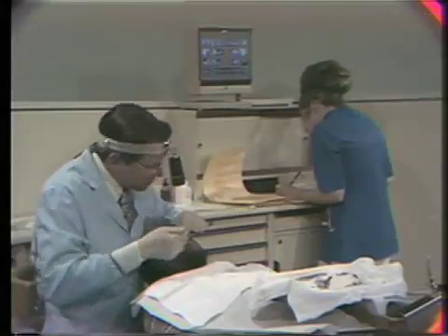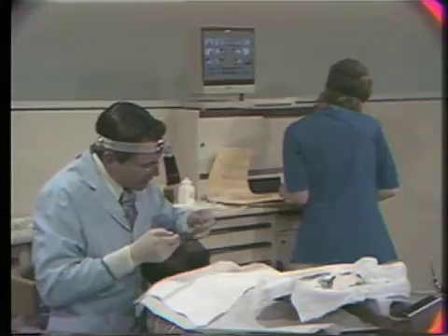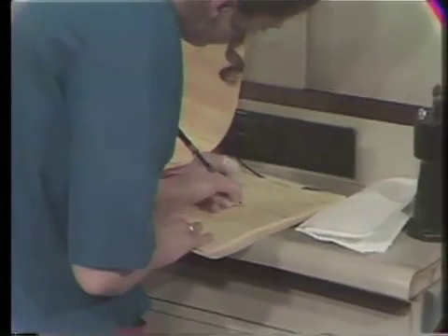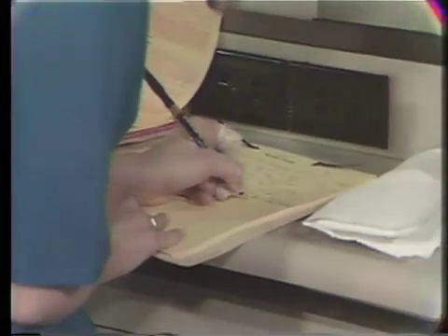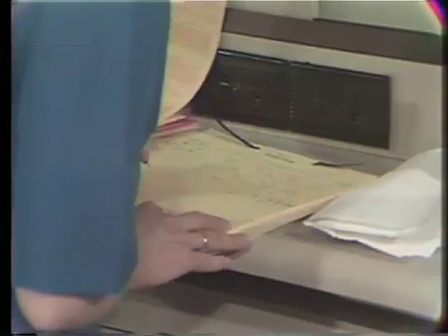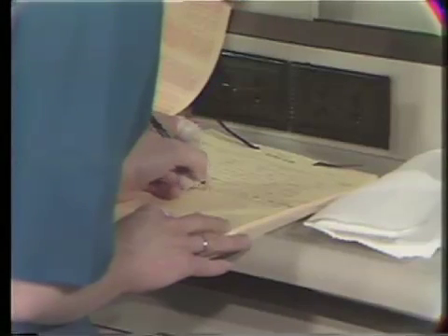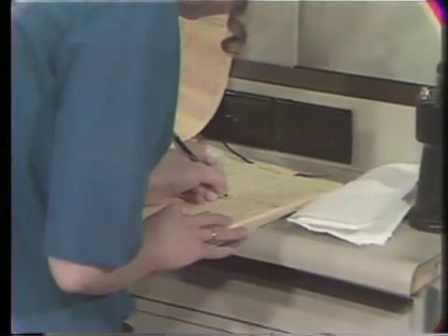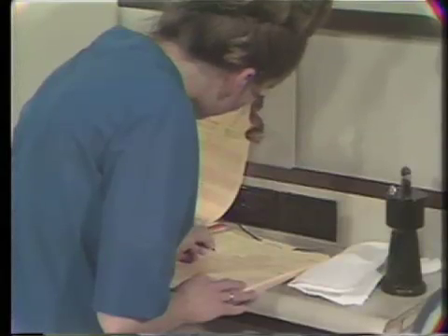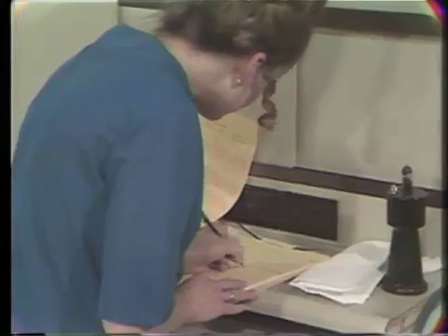Two and a half cc's of 2% xylo. WL and WB number 9 through 12. DW on 12. No osteoplasty. 1S and 1R suture. Now those are my own abbreviations for what we did. WWP. Bite on down now. Open. We check for muscle trim, check for occlusion, check for comfort of the patient.